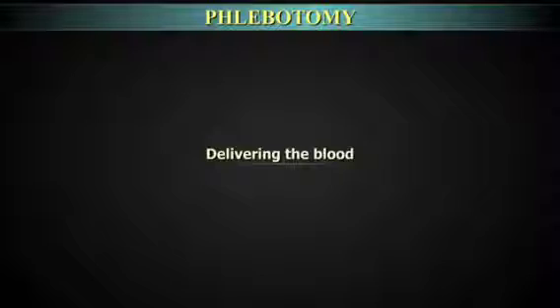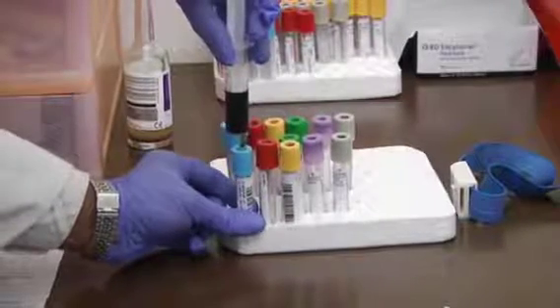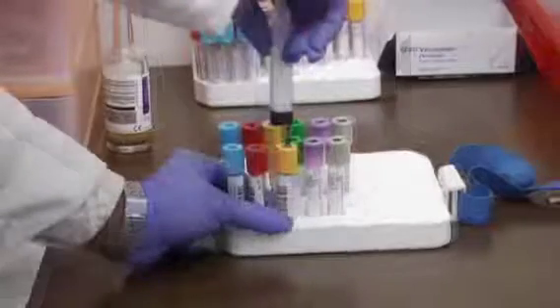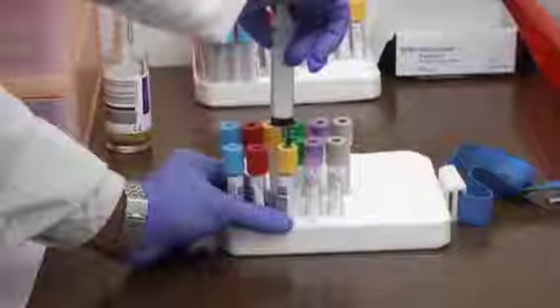Delivering the blood. Deliver carefully into respective tubes as per requirement for test ordered and in proper order, which shall be discussed shortly.